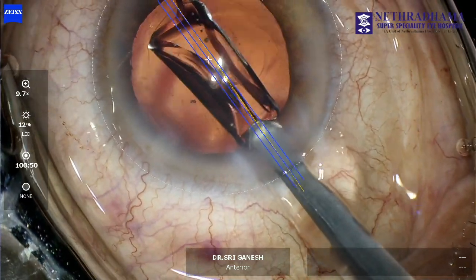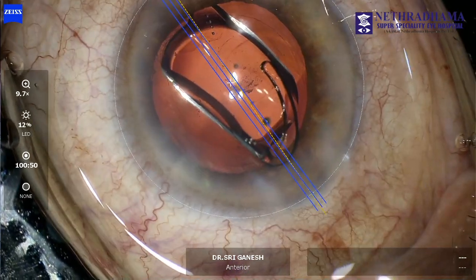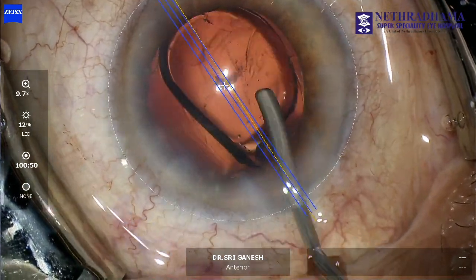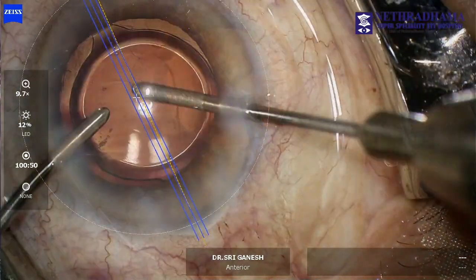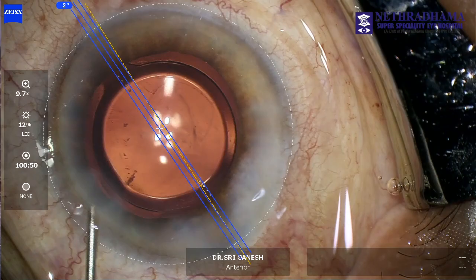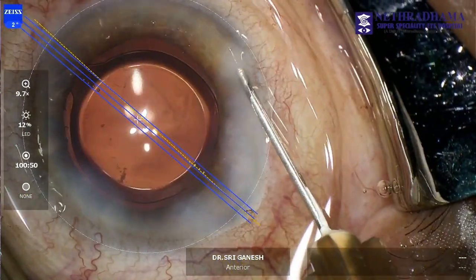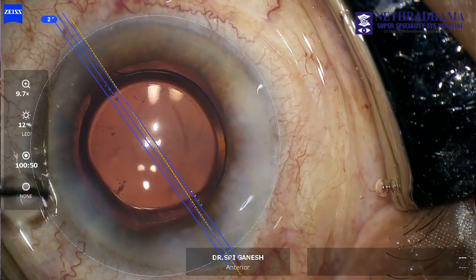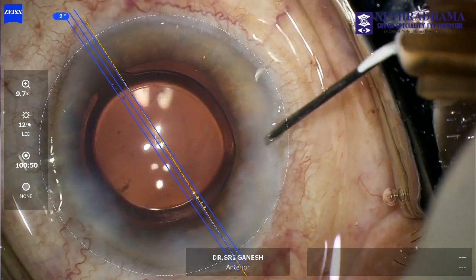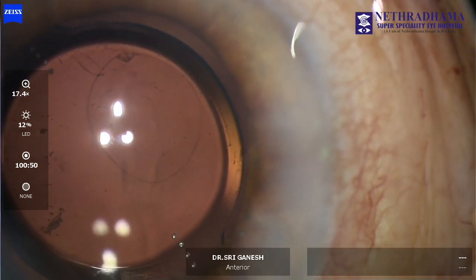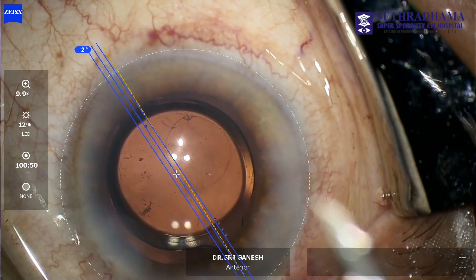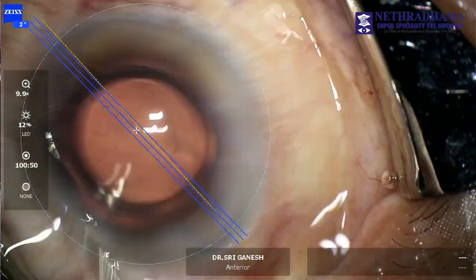We put in the toric IOL into the capsular bag. For a toric IOL especially, you should ensure that there is no vitreous in the anterior chamber or the bag, as this will prevent proper placement of the IOL, and it will not remain on axis and can rotate post-operatively. Once the IOL has been placed, the viscoelastic is removed and the wound is hydrated. You can see that the lens is very well aligned and does not move, and it is well centered in the bag with a good overlap of the rhexis margin. The PCR punched-out area shows no distortion because there is no vitreous tugging — this is a sign that you have cleared all the vitreous and the lens will be stable.